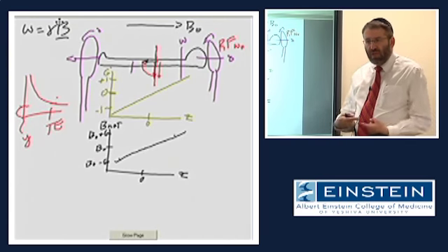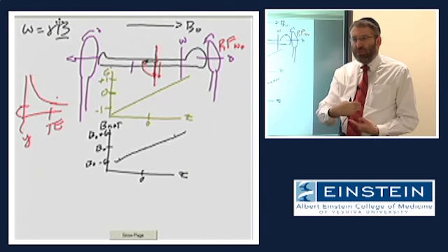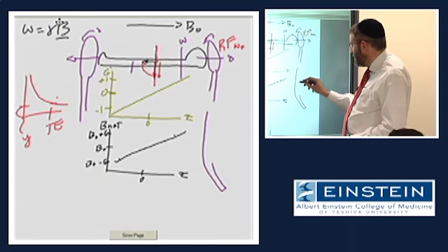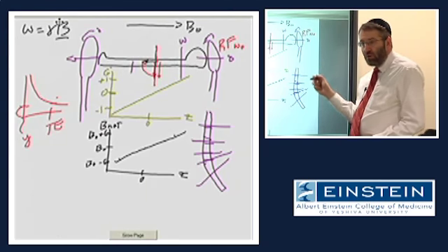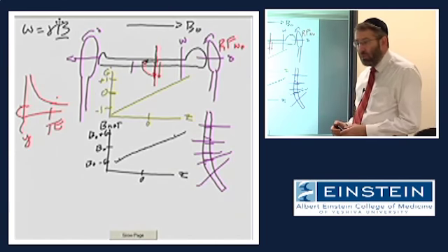If you're doing the spine and you want a sagittal image, what would you do? You would simply turn on the x gradient magnetic field going right to left, which would select slices perpendicular to its direction. And as many of you know, when you look at the lumbar spine, we always want these slices that go parallel to the disc spaces at different oblique angles. So having axial, coronal, or sagittal really isn't sufficient for what we want to do.